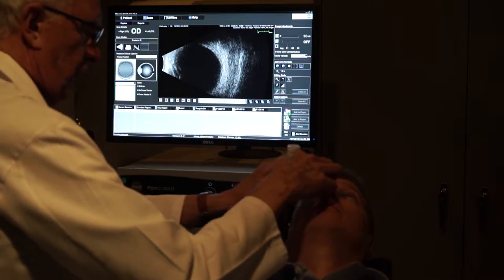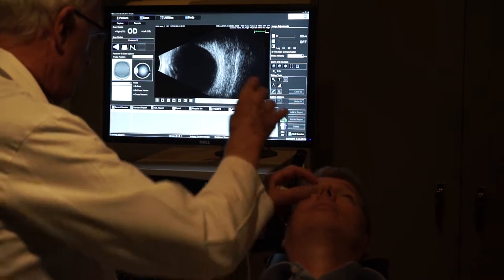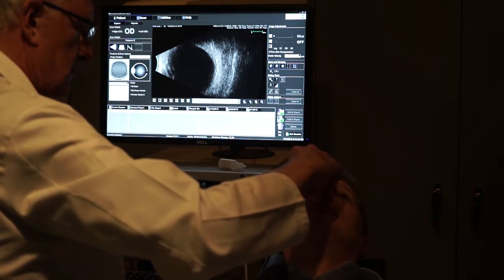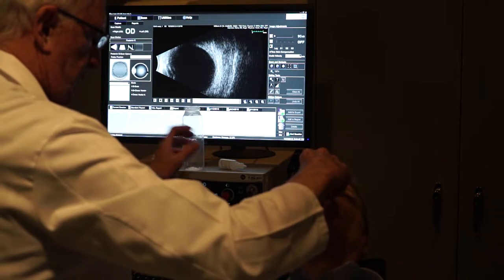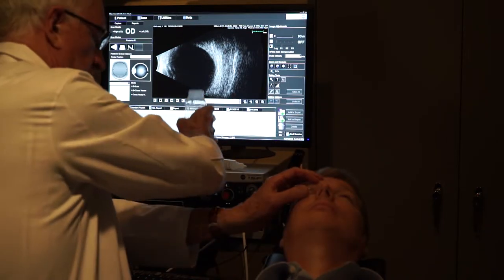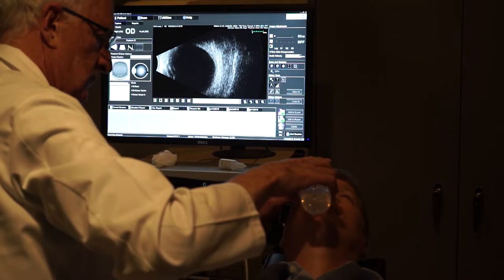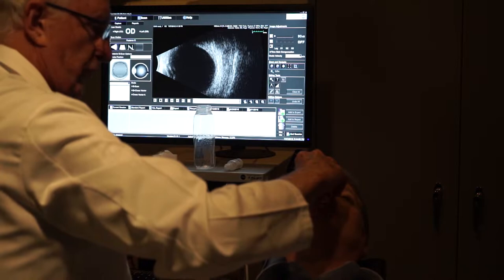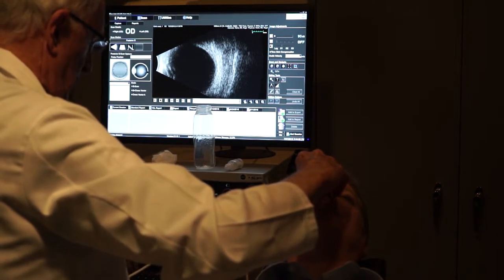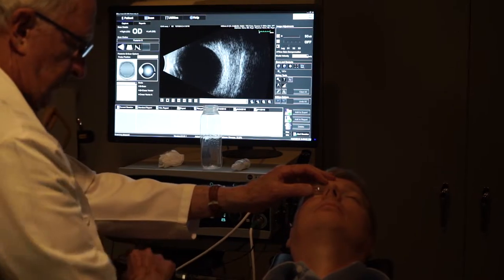I'll put a little bit of methylcellulose inside just to seal it so the water doesn't come streaming out. Then I'm going to put some water — it might run down your face a bit but it's just water. We usually use distilled water. Saline can sometimes get into the probe and cause problems, especially with the open probe like we use in UBM.